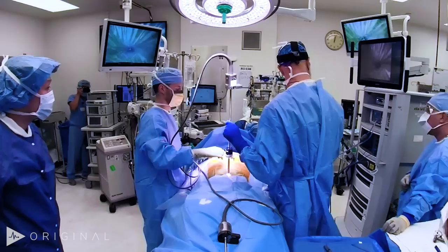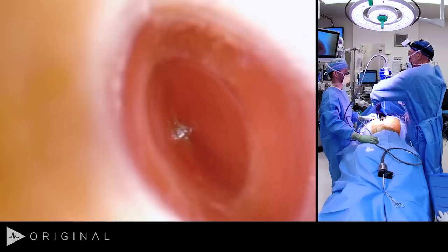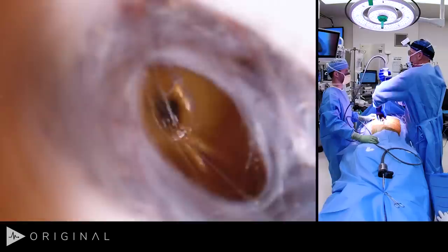Direct optical technique on the insufflated abdomen: sub-Q fat, anterior rectus sheath, rectus muscle — this patient has a pretty beefy rectus muscle — posterior sheath, and then peritoneum. Once we're in the peritoneum, we can advance the port. We'll switch out to the 30-degree scope now.